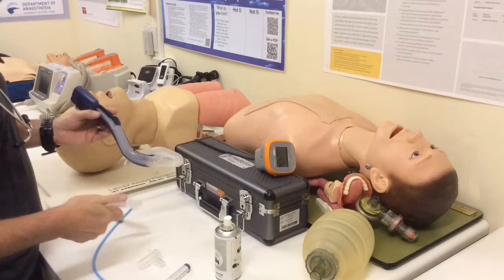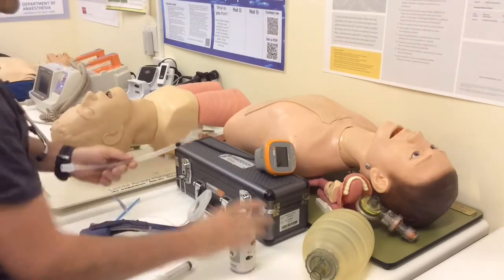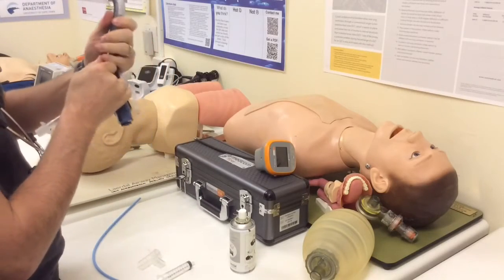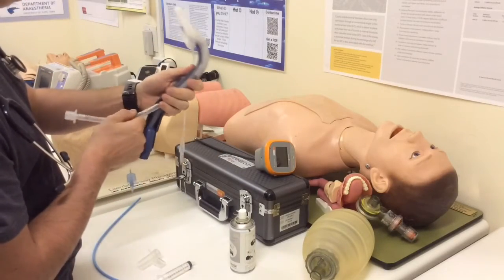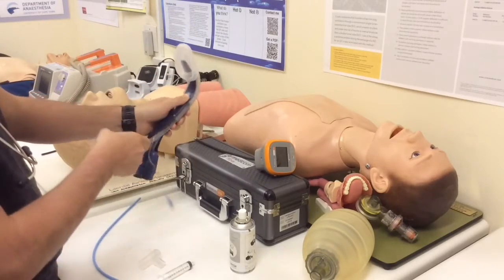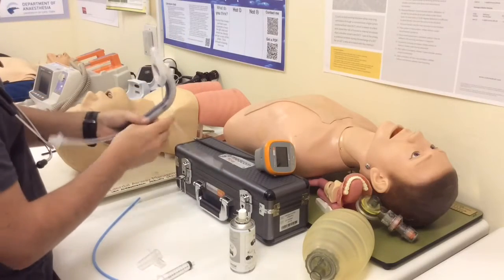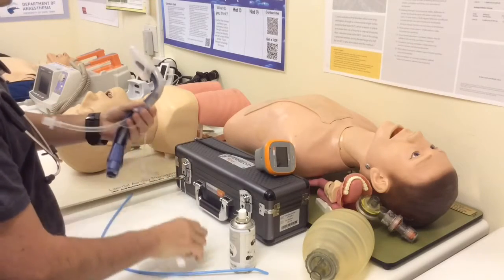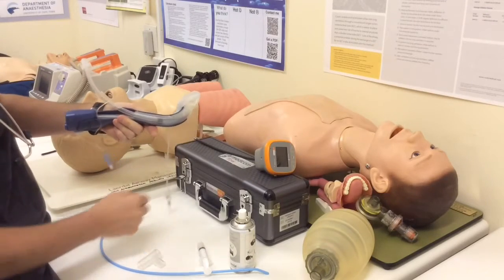When you want to use this device, you take it out of its packaging, you check and lubricate your endotracheal tube, and then you load the endotracheal tube into the side channel here. I like to give it a twist to make sure the lubricant is smoothly spread. And the cuff of the endotracheal tube sits just inside here. And where it's inflated, it occludes this channel, and the endotracheal tube becomes the stem. There's some depth markings here, which allow me to get the distance right there, and then I can blow up my endotracheal tube cuff, and right. Now, my endotracheal tube is fixed, and it's functioning as the stem of the laryngeal mask.